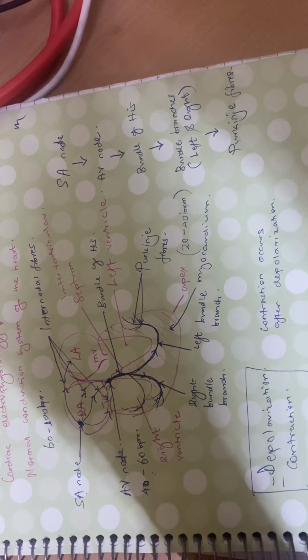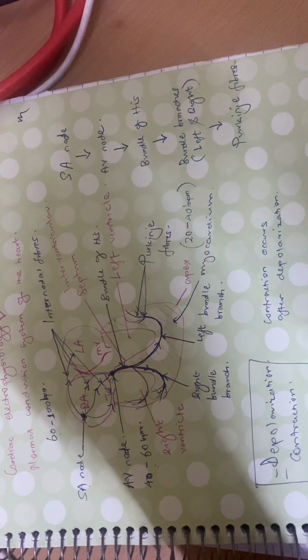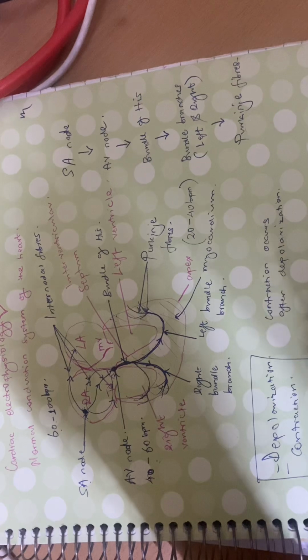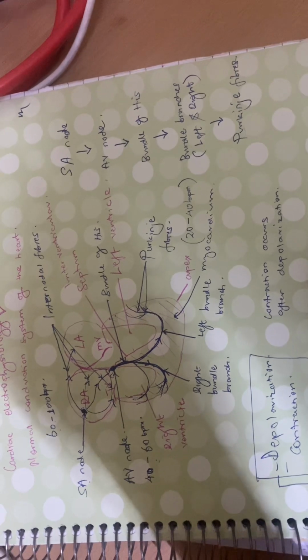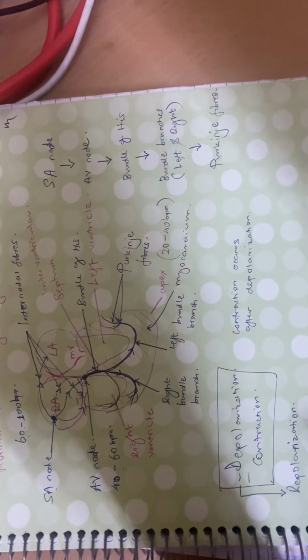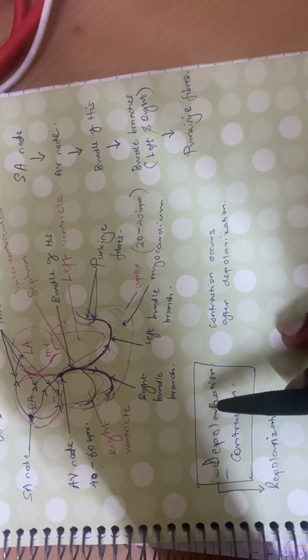So if we are recording the ECG, we are recording the waves of depolarization and repolarization. After depolarization, there must be repolarization. So with the ECG, we are capturing all those things. We are capturing depolarization and then repolarization. Depolarization first, and then we go to repolarization. So with the ECG, we are recording the cardiac electroactivity in terms of depolarization and repolarization.